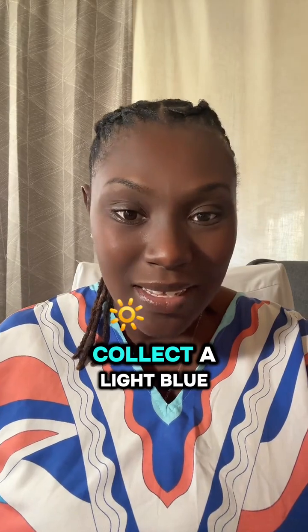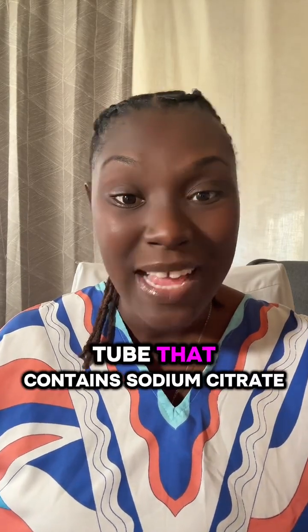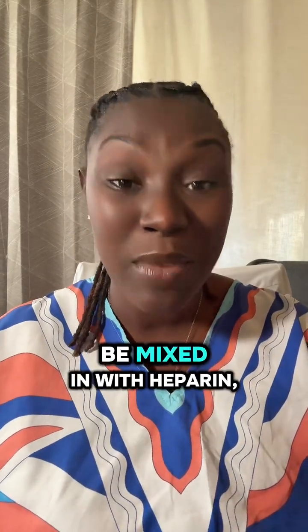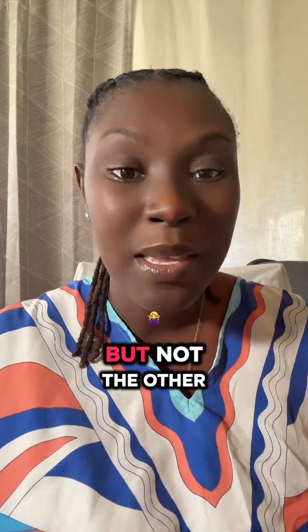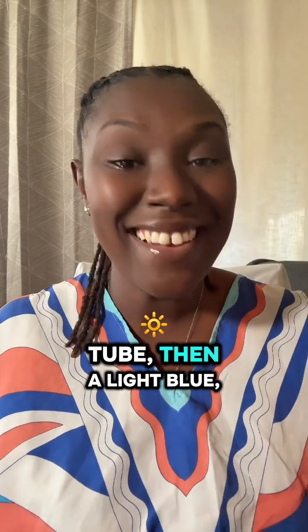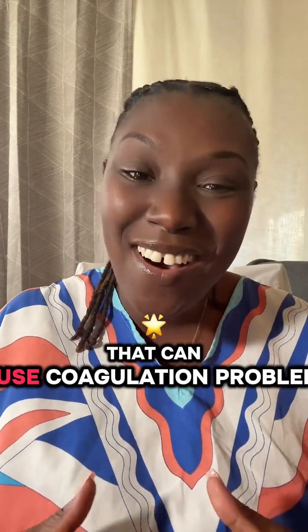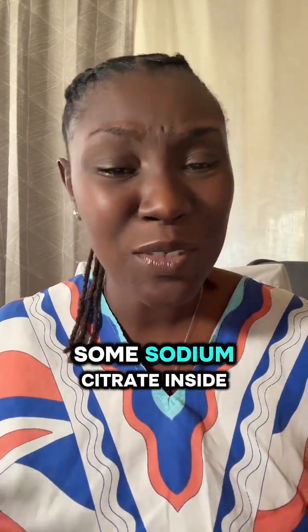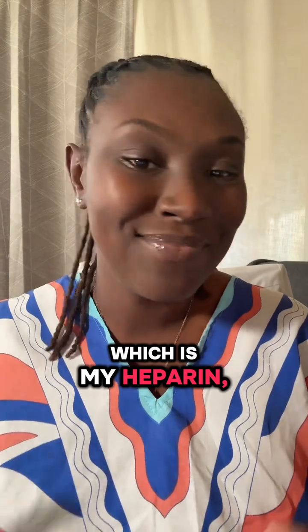So, let's start off this way. If I were to collect a light blue tube that contains sodium citrate additive, that can easily be mixed in with heparin, but not the other way around. If I were to collect a heparin, which is a green tube, then a light blue, that can cause coagulation problems. But if I have some sodium citrate inside of a green tube, which is my heparin, there's no problem there. Let's check another one.